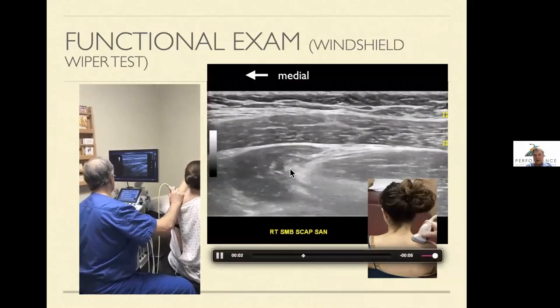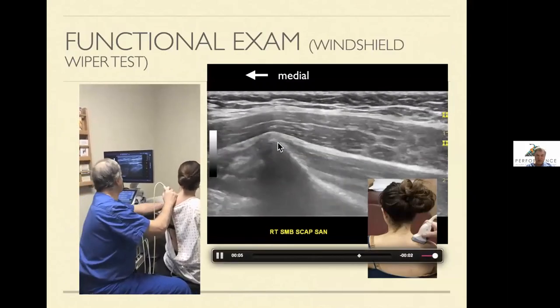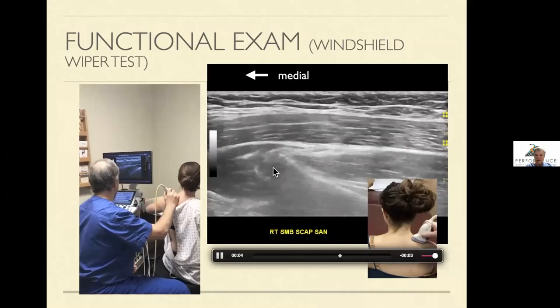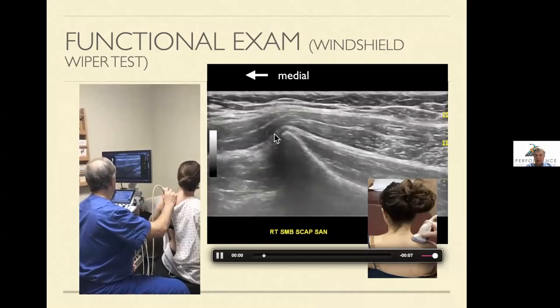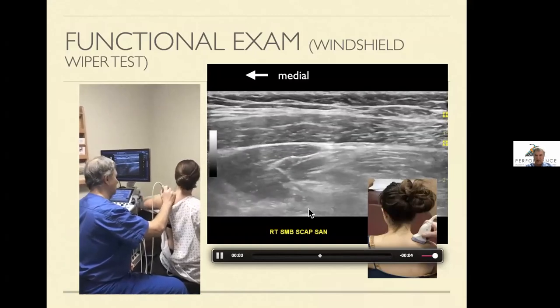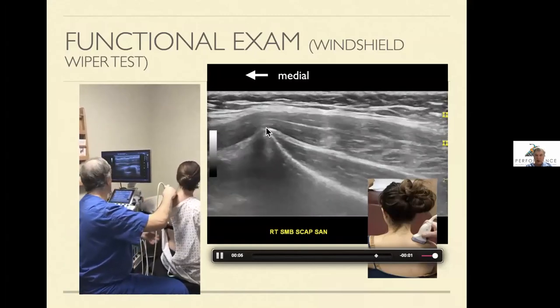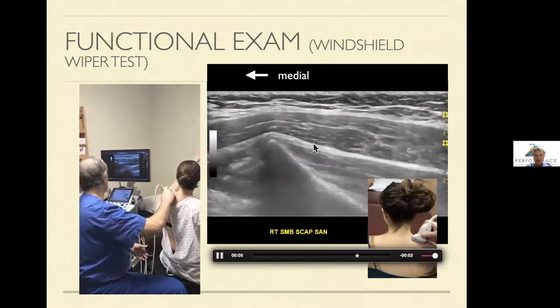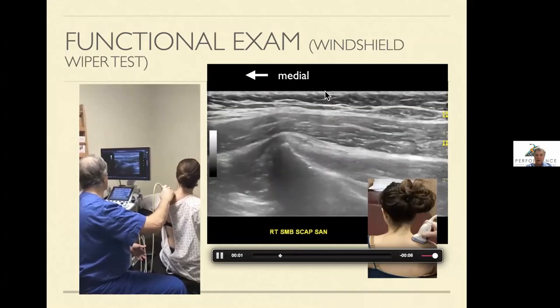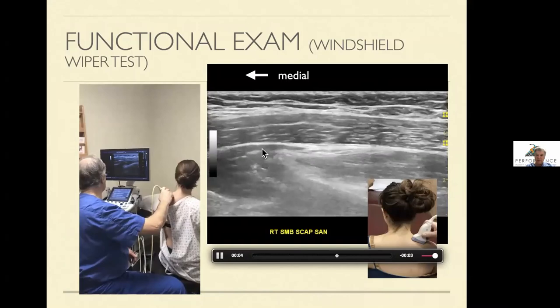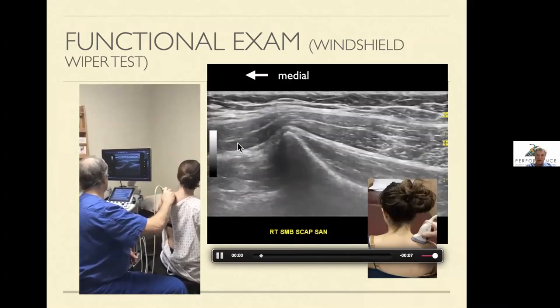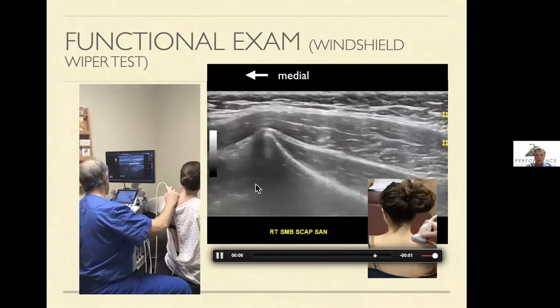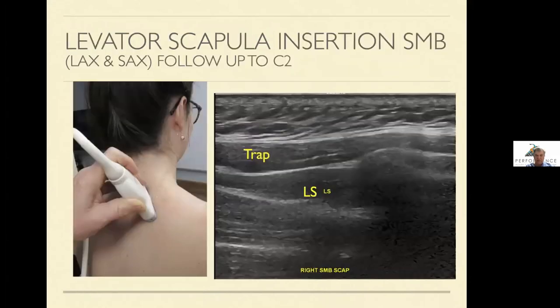Once I've completed that, I do a functional component of my exam. I'm looking for whether the patient has a punched-out lesion at the medial superior border of the scapula. Between flexion and extension as I come up, I'm going to see this punched-out lesion, which creates inflammation and irritation of the spinal accessory nerve in this fascial layer. Here are trap, soft connective tissue, and superficial fascia — but these are all spinal accessory nerve fibers running down to innervate the lower trap. In our patient, this was a very positive component of the examination.